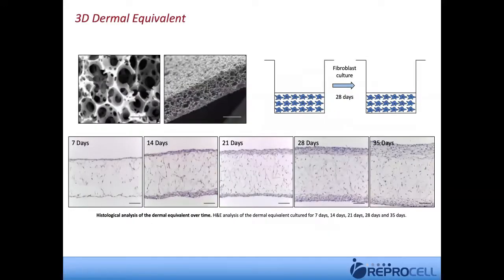So first of all, to produce skin, what we do is we use primary fibroblasts. We take those fibroblasts from explants of patient material, and we explant them into culture, and then when we've generated sufficient cell populations, we will then seed them into the Alvetex membrane. And we're doing this in a well insert. This can be a 12 or 24 well or 96 well insert.